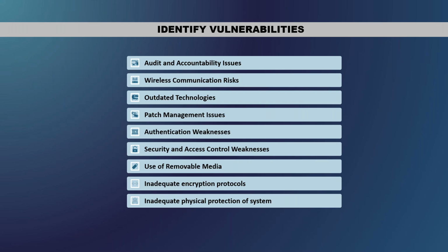And then inadequate encryption protocols. So the potential lack of acceptable levels of encryption for data at rest and or in transmission. Clear text and unencrypted data storage or transmissions present security vulnerabilities. Too many times you can look into a database that a medical device is using and see the patient information right there because they haven't masked it. It's not encrypted. It's just a plain text database.